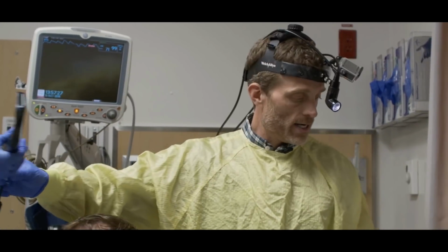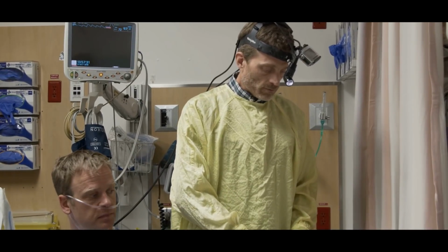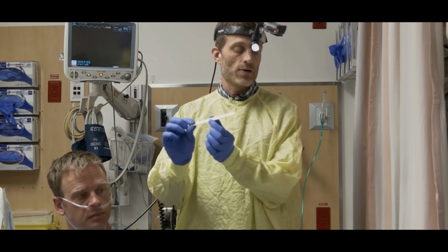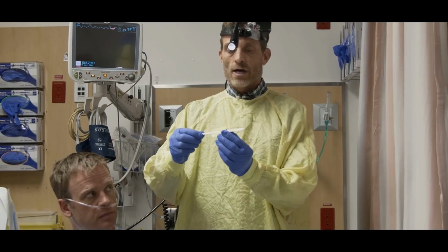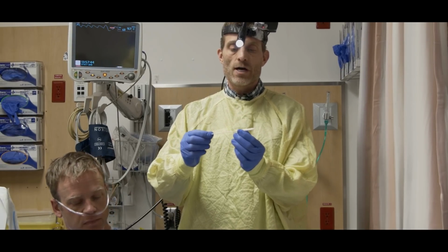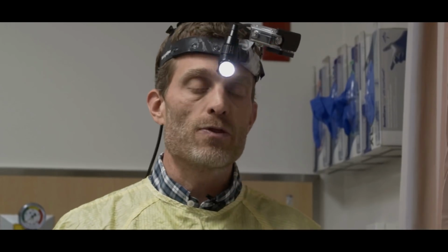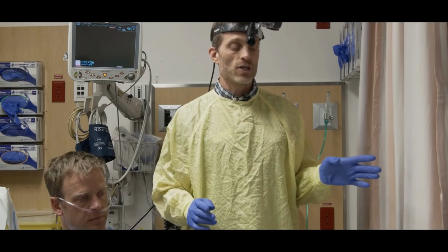Yeah, thanks a lot. So let's go over how much lidocaine we just used. We used one 3-inch segment, so that's 80 milligrams. And we used kind of a third of the other, let's even say we used half of the other one. So 80 milligrams plus 40 milligrams, 120 milligrams here. Chad started with the nebulization of 1 cc, which is 40 milligrams. So that's, where's my math? You're at 160. I'm at 160 now.